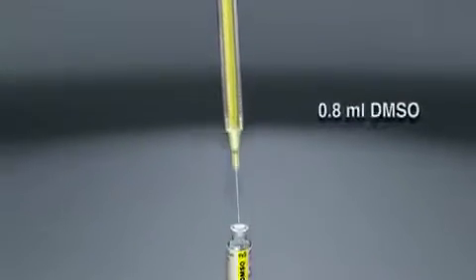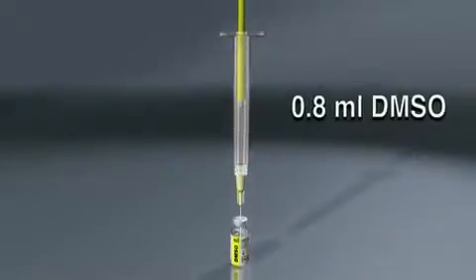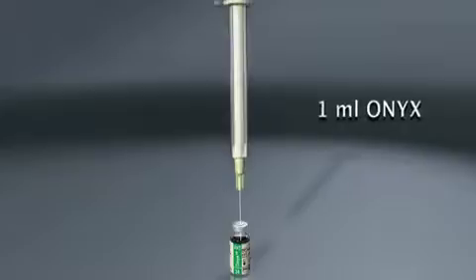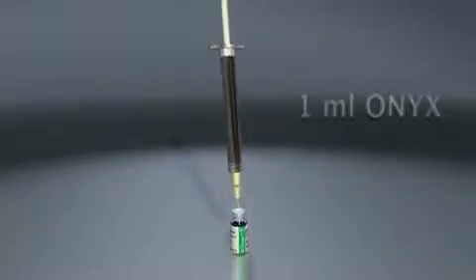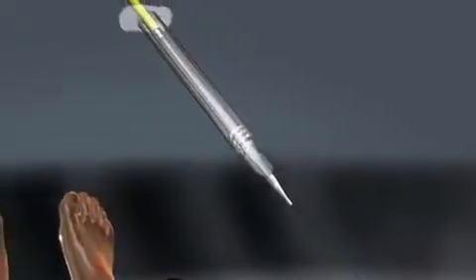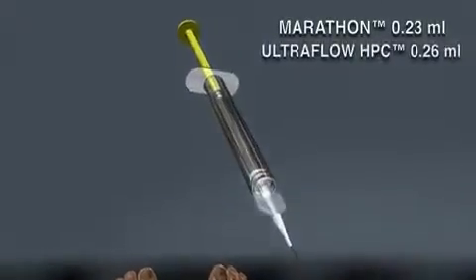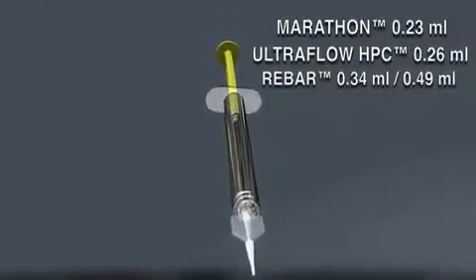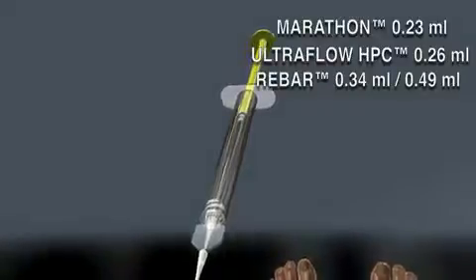Aspirate approximately 0.8 mL of the supplied DMSO into the yellow 1 mL DMSO syringe. Next, aspirate exactly 1 mL of the mixed Onyx into the white 1 mL Onyx syringe using an 18 or 20 gauge needle. Connect the yellow DMSO syringe to the delivery catheter and inject the DMSO in sufficient volume to fill the catheter dead space. The catheter dead space is called out on the catheter package; in the case of the Marathon Flow Directed catheter, the dead space is 0.23 mL.